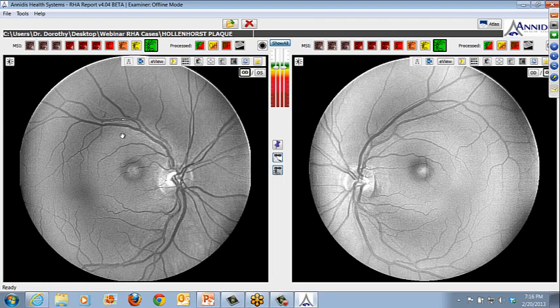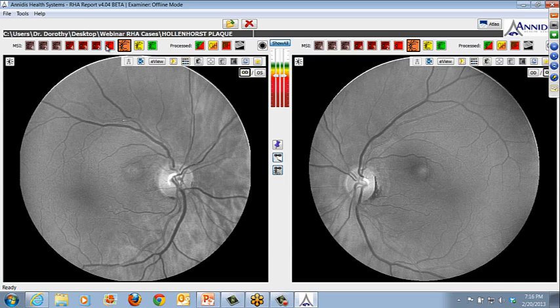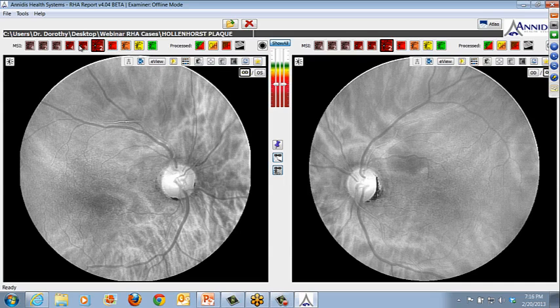Sometimes people have a little bit of difficulty differentiating what type of plaque there is. If you recall, Hollenhorst plaque is hyperreflective. It will often look larger than the lumen of the arteriole, the retinal arteriole, because it's more refractile. In this case, because you're using the low light LEDs, you can actually very nicely see that plaque sitting right in the center of the vessel. And you certainly know it's in the vessel. As you go past, it will fade. You'll see it, though, all the way down through.